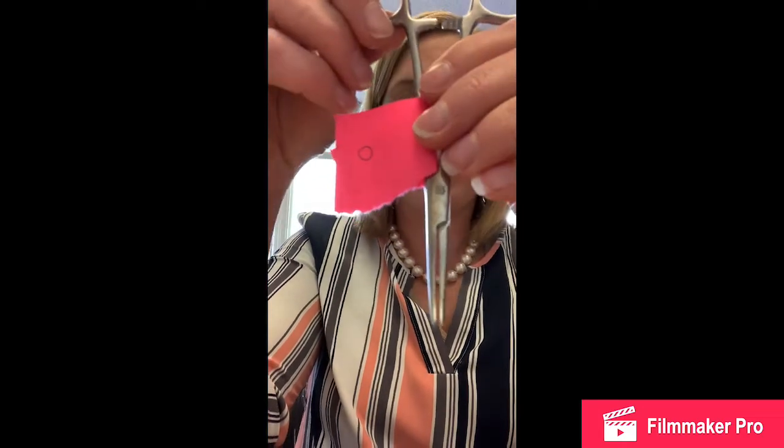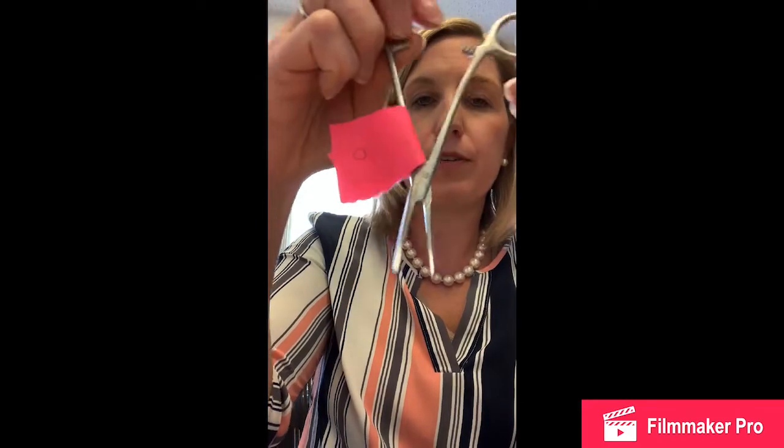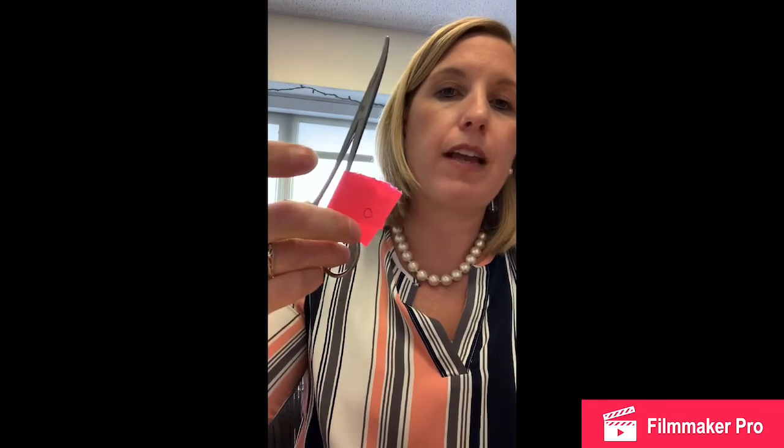This instrument, this is a snap or a hemostat, okay? This is an instrument that's very frequently used to tag suture if you're trying to keep something, to tag something, to note it, okay, to make sure it doesn't get lost. This can also be used as a small dissector. It has a kind of a daintier, pointier tip, kind of similar to the tonsil or the Crile. If you were to put some plastic pieces on the end of this, sometimes they're yellow or red, you make this into a rubber shod, which you can use to tag very tiny 4-0, 5-0, 6-0 suture so you don't crush the suture. But this is a snap or a hemostat, very familiar instrument.